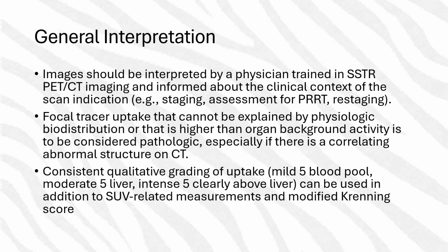Images should be interpreted by a physician that's trained in somatostatin receptor tumor imaging, and informed about the clinical context of the scan, staging, assessment, restaging, all of that. Focal tracer uptake that cannot be explained by physiologic biodistribution or that is higher than the organ background activity is to be considered pathologic, especially if there's a correlating abnormal structure on the CT.